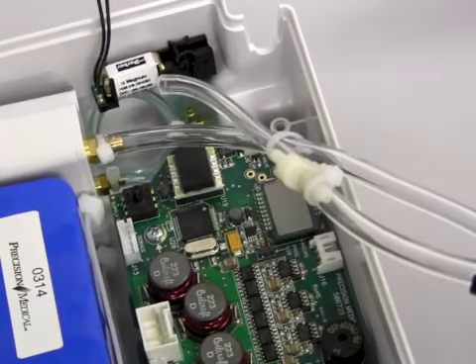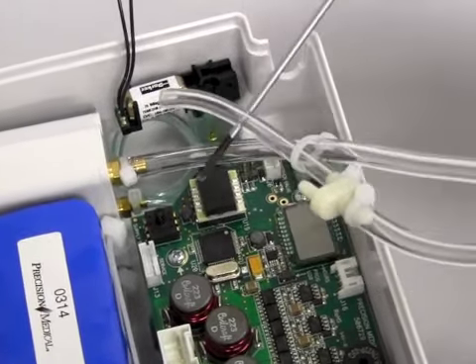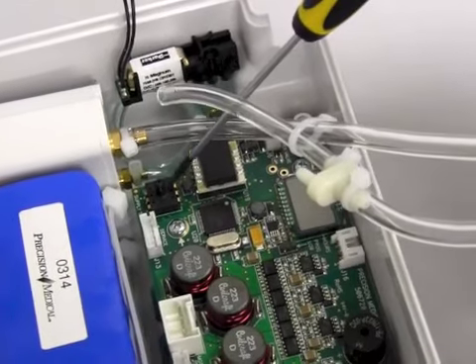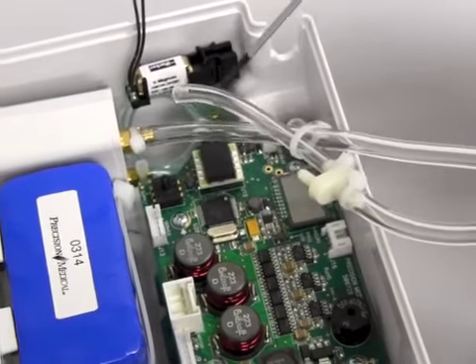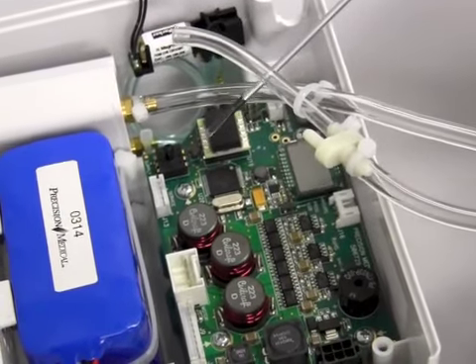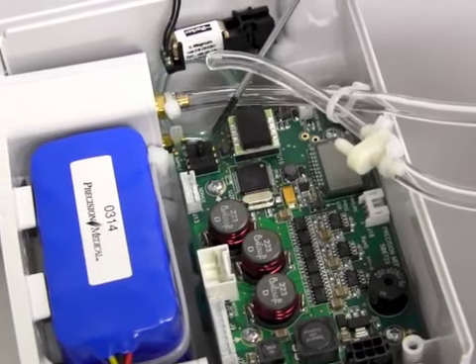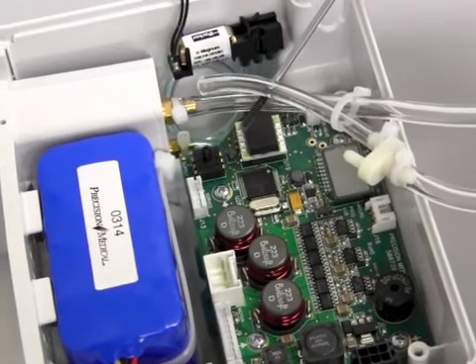The next step is to attach the Tygon tubing that I'm pointing at here back onto the pressure sensor on the circuit board. When you do this, it's best to put the wire tie onto the Tygon first, then push the Tygon onto the pressure sensor, and then pull the wire tie snug.